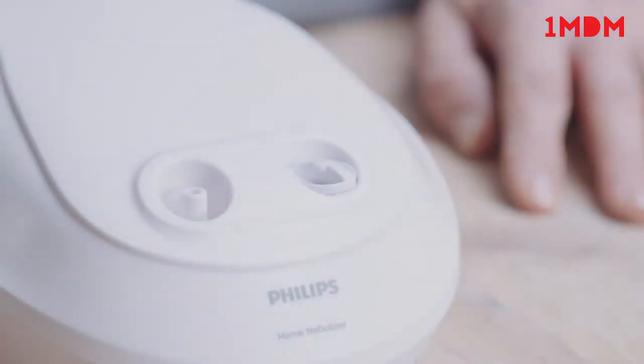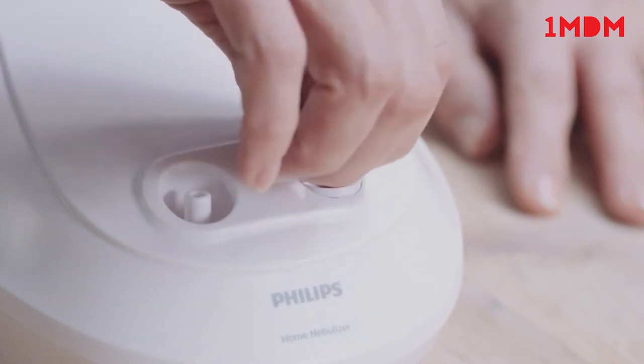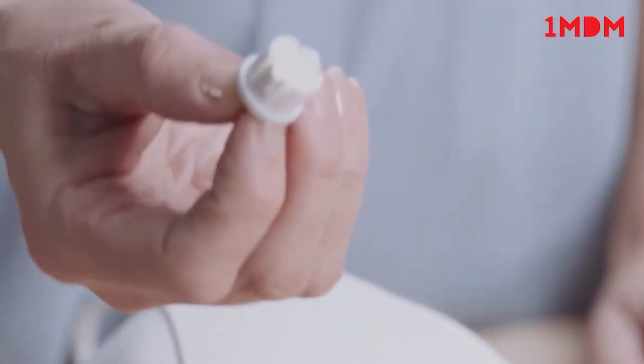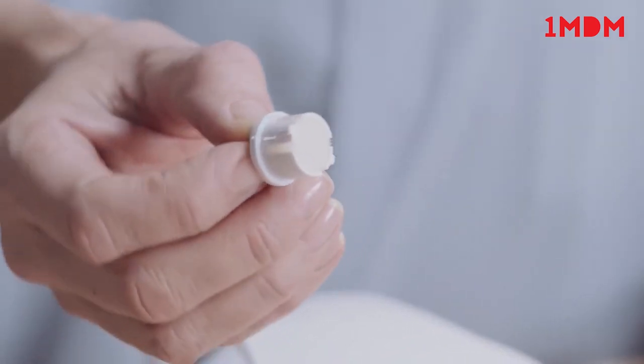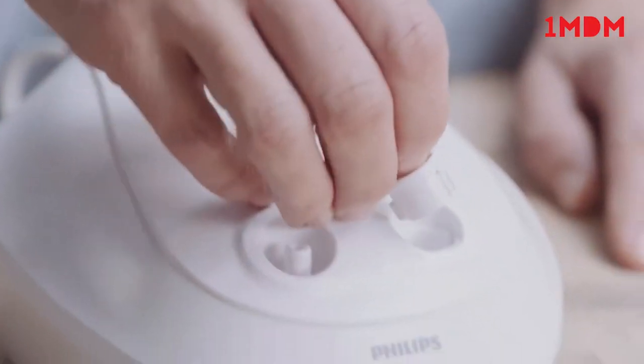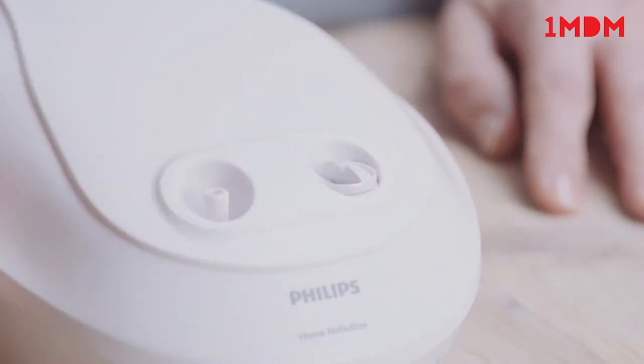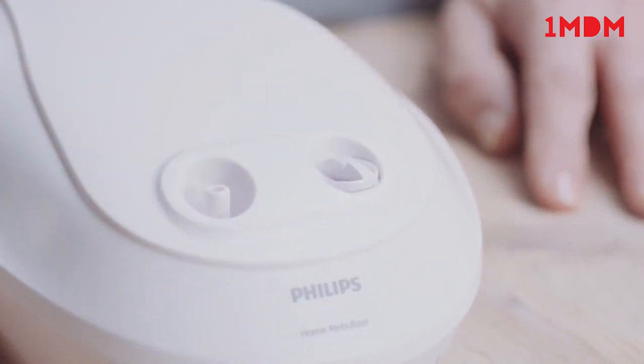The filter should be checked regularly and replaced when it becomes discoloured, dirty, clogged or wet. To change the filter, twist the filter cap and remove it by gently pulling it out. When replacing the filter, make sure it is fully inserted and twist it to lock it in place. Don't wash or reuse the filter and don't use the unit without one.